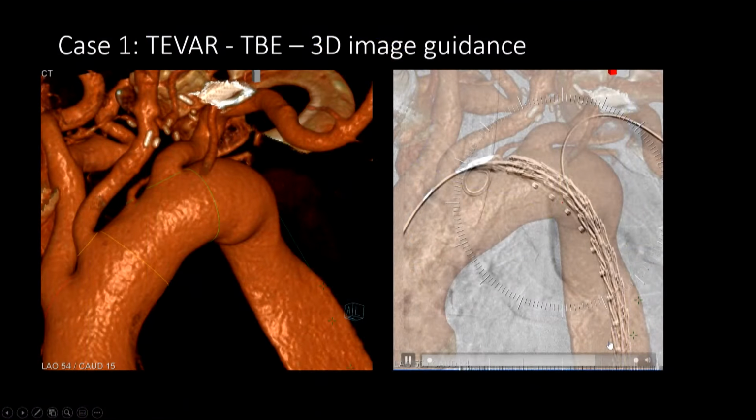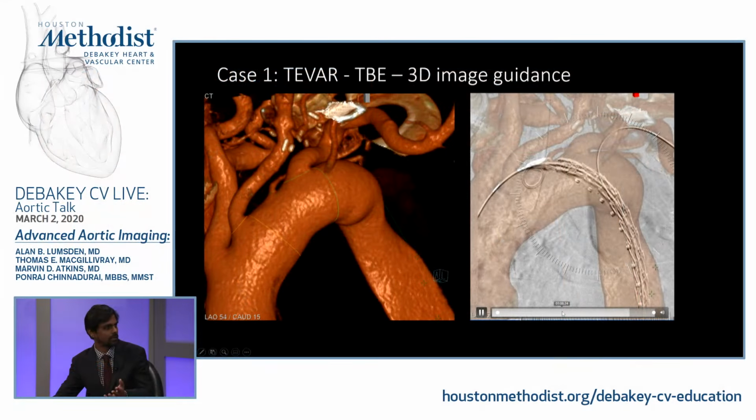So this dial here, you can see me manually matching it to the aorta. Once it is matched by these extra 2 or 3 millimeters, it might look like a lot here, but we are in a higher zoom. So it looks like we are moving it, but we are moving by 2 or 3 millimeters. Gotcha. And once you readjusted it, it can track with change in zoom and angulation.